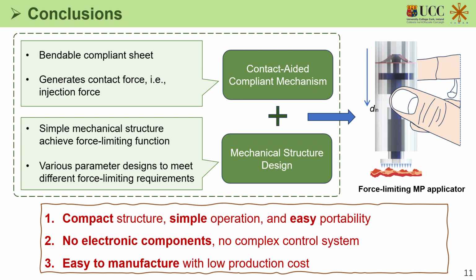Lastly, let's come to the conclusions. In our project, we proposed a force limiting microneedle patch applicator. It is a compact structure and easy to use. As it is without any electronic components, it is easy to manufacture and has low production cost.